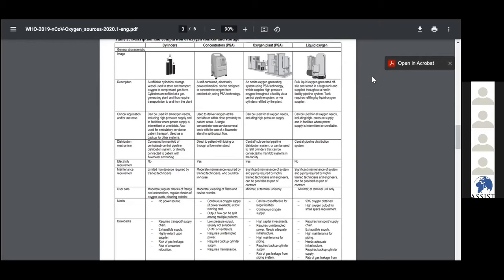These are the machines which are planted somewhere to absorb the air with nitrogen, oxygen, all these components of gases which are in the atmosphere, and they extract oxygen, like in photosynthesis, as you said.